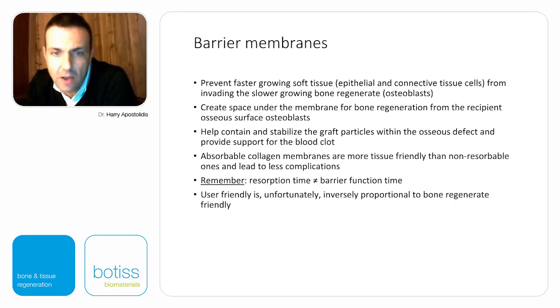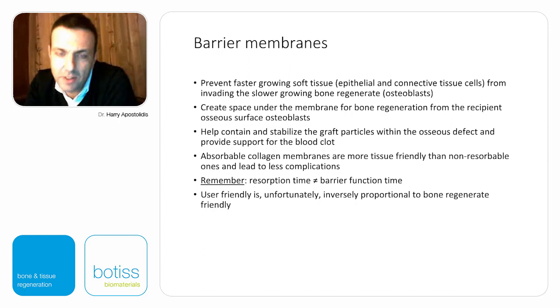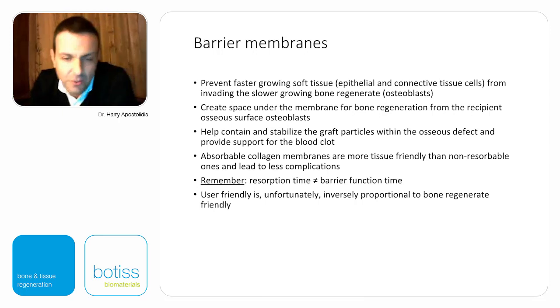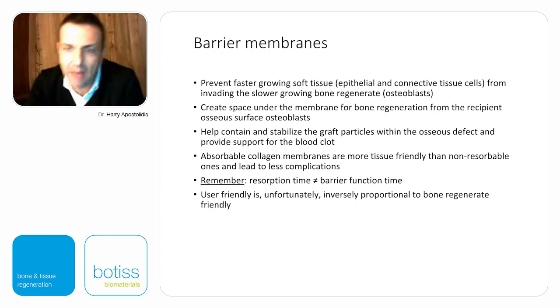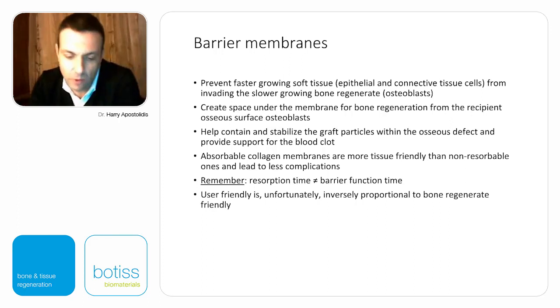And unfortunately, I know that you want to use stuff that is user-friendly, but as far as membranes are concerned, if you prefer a more user-friendly membrane, you probably have to settle with a shorter barrier function time. Unfortunately, the membranes that last longer are not that user-friendly, but they work better, and I like them to work better. I don't mind being a little bit frustrated when I work, as long as what I put in there gets me to where I want with better results.